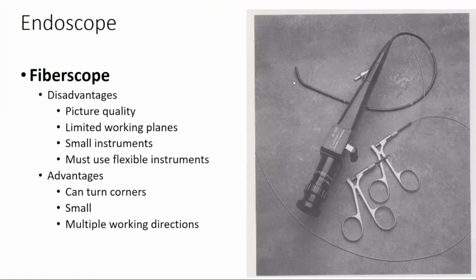Because the flexible endoscope is small, the port that you see here is obviously small. So the only instruments that can go through are these thin flexible instruments that are, again, useful for basic maneuvers, but you can be limited, for example, if you want to do some intraventricular dissection.